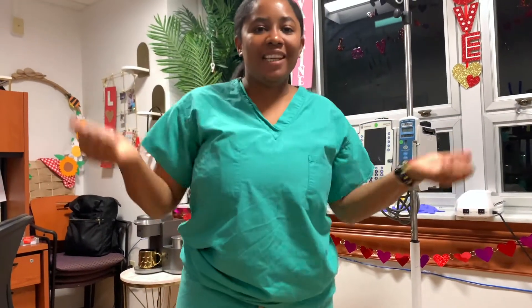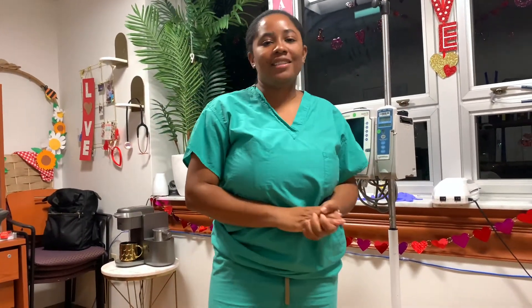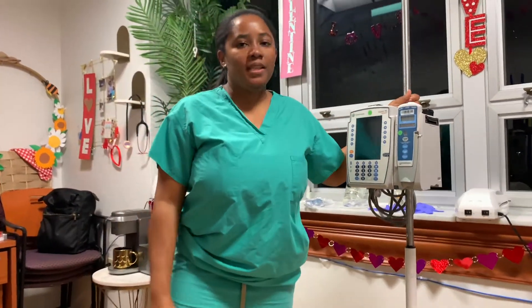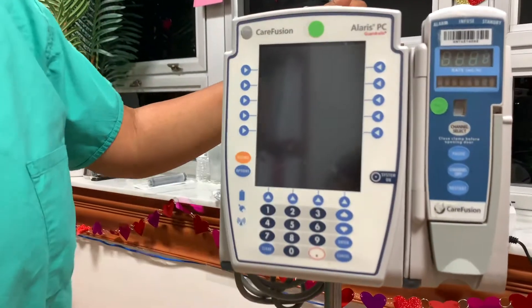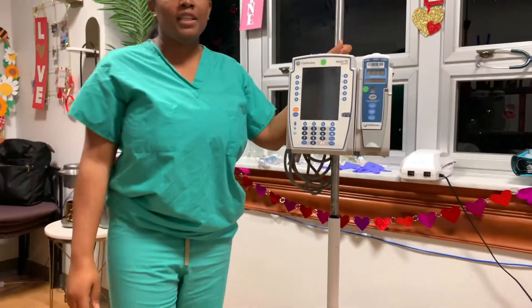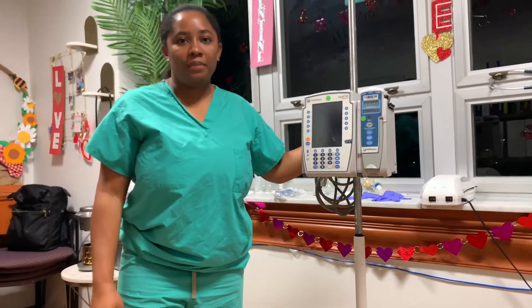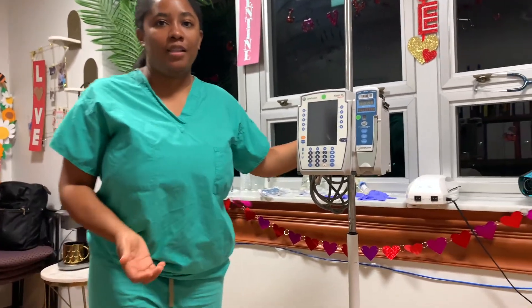Hi guys, how are you doing? So for today's video I'm just going to go ahead and show you guys how to prime an IV line — that includes a primary and a secondary. We're all going to use this pump here, which is the Alaris PC Guardrail pump, CareFusion. Of course there are different pumps out there, but this is the one that we use in my facility, so we're just going to go ahead and use this.